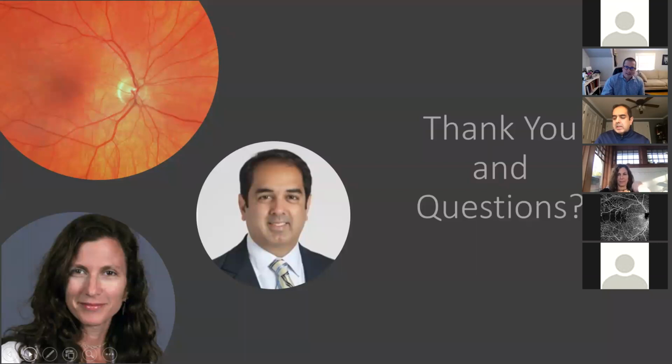I mean, I think that's one of the things that we've learned a lot from wide field angiography, is that IRMA might look like IRMA to you and I, but then when you look at the far periphery, there are some neovascular tufts we might have missed and not seen necessarily with 7-field standard imaging. So pretty much at that level, if there's the level of IRMA, NVE, or NVD, I'm not measuring as much, and I love the methodology.